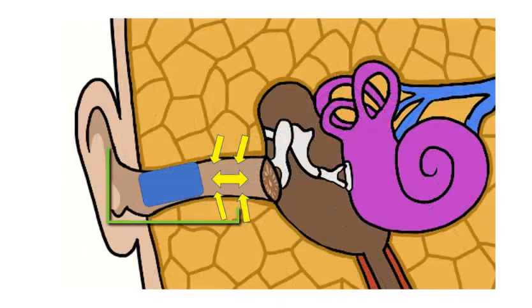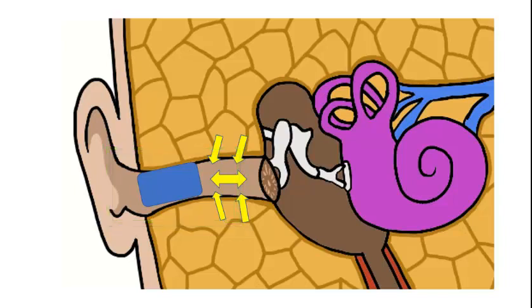When we occlude the ear canal with a plug or earphone, however, the slug of air gets trapped within the now enclosed cavity of the external canal. Acoustic energy that emanates out from the bony structures that support the ear canal now creates sound pressure levels within the slug of air that is trapped. This energy is then directed towards and into the middle ear. From this point, it has entered the auditory system proper. This will affect lower frequency signals more than high frequency signals. This is the occlusion effect.